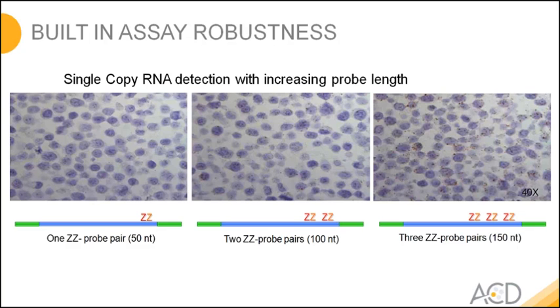The sample we look at here is HeLa cells, so it's kind of a perfect sample, with very nice RNA quality and easy to prepare. In the real world, with clinical samples, for example, you face some kind of RNA degradation. It's more difficult to pre-treat the samples correctly. This is why this additional robustness is needed and why we feel this assay has a clinical grade now.